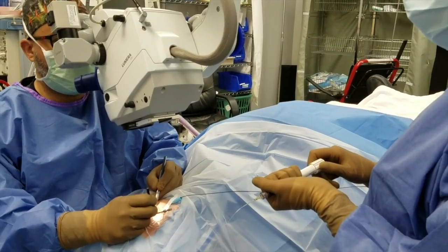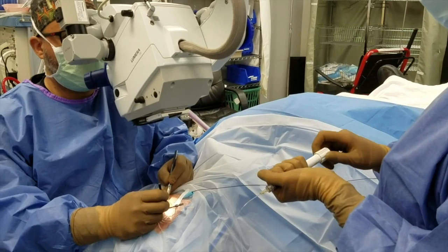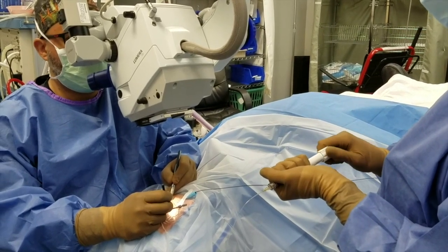Here we will retract the catheter. As I begin to retract the catheter, I will ask my scrub tech to start clicking on the viscoelastic injector. And you can see that clearly there.